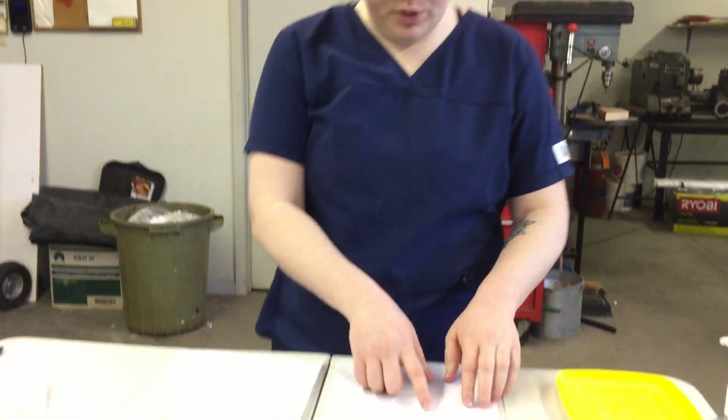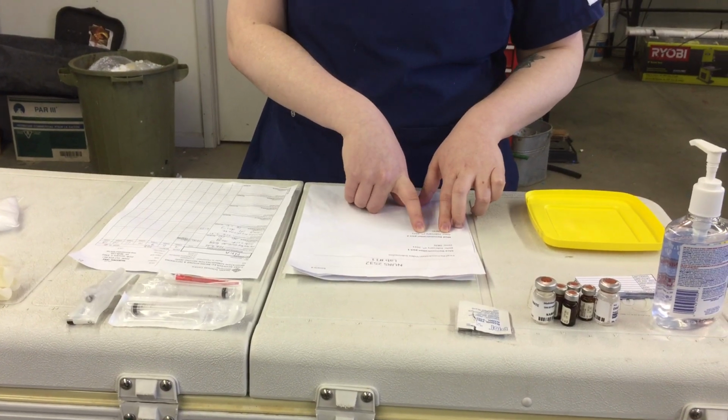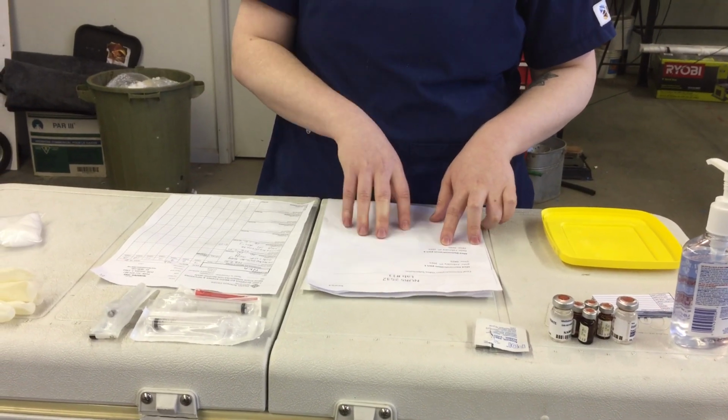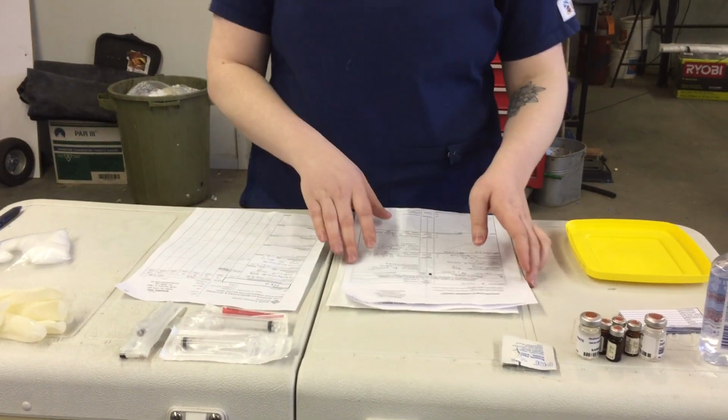So the first thing we're going to do is check our scenario here. Our scenario is med demonstration part 2. The date is February 7, 2021, and the time is 20:30, and we're going to be administering medications today. After I've done that, I'm going to compare my physician's order with my MAR.